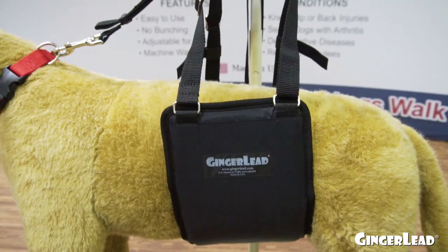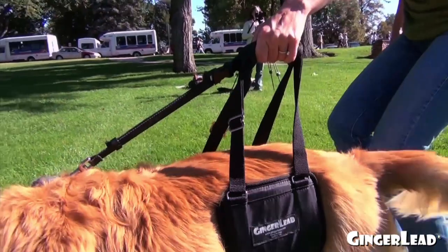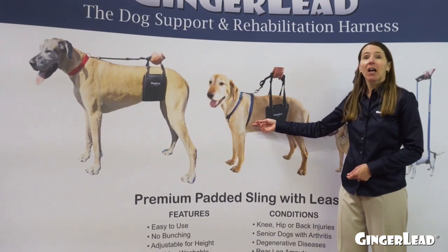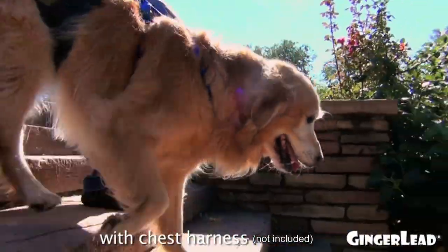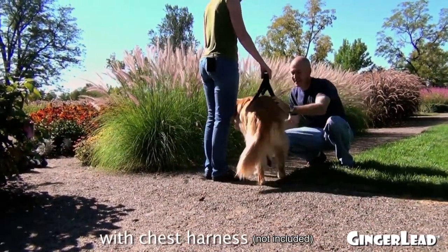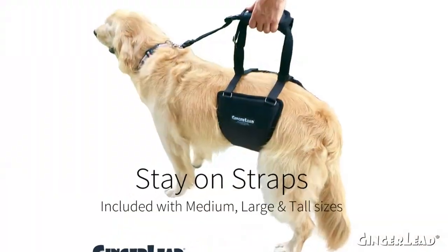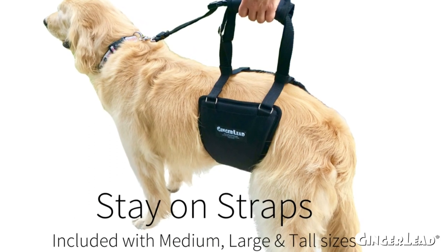We attached it to our dog's collar when she was young and recovering from orthopedic surgery, which was great and gave us breaks. When she was older and had arthritis, we attached the leash to a standard chest harness like the blue one here. That was wonderful because we had stairs at home — if she stumbled going down the stairs, we didn't want to pull on a collar around her neck. This gave us something under her chest and under her belly and one handle to hold on to — sort of a doggy suitcase.